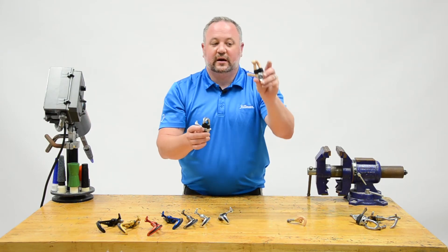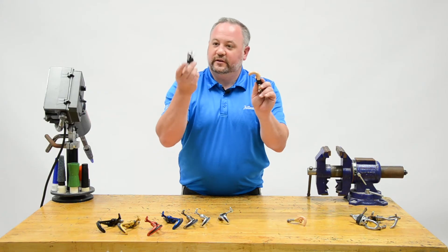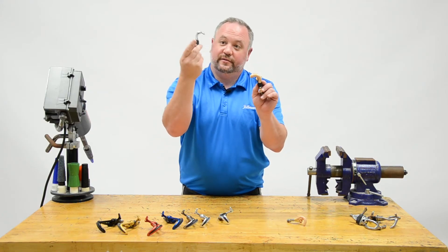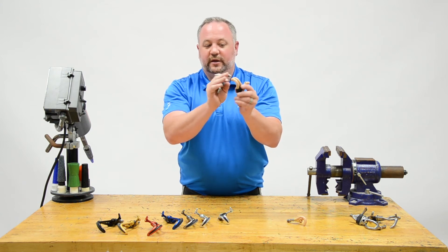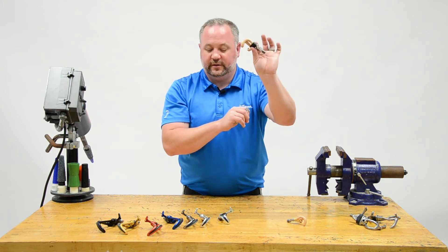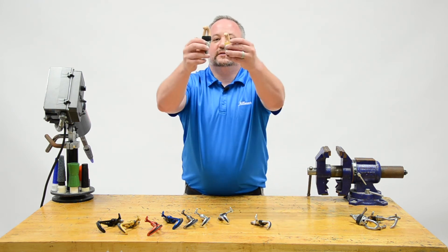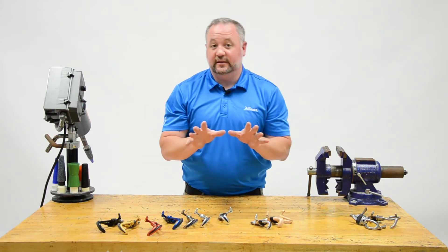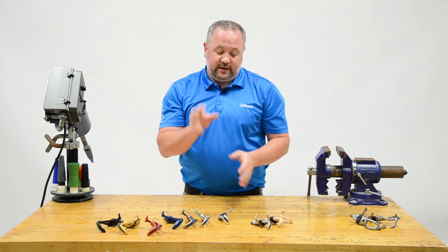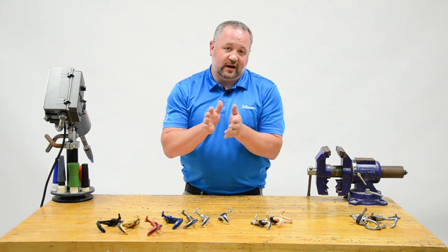If the 99X is a little large, I can go down to the 10X hook, which is also nitrile coated and a little shorter than the 99. The 10X comes with a plastisol coating option — and for a pediatric patient, the plastisol coating is really a safety feature, so a child isn't using a sharp hook against another child. It comes in two colors: light and darker plastisol. Going down further, the size 12 hook only comes in plastisol — a safe hook for very small children. Pediatric hooks get a different billing code than adult hooks, which is one of the most commonly missed items.